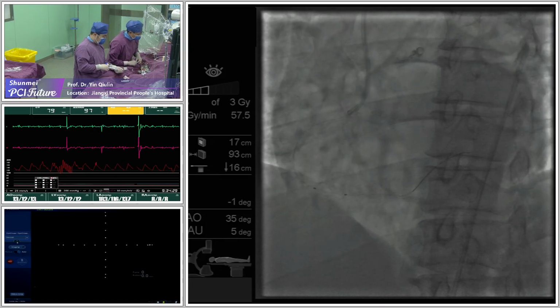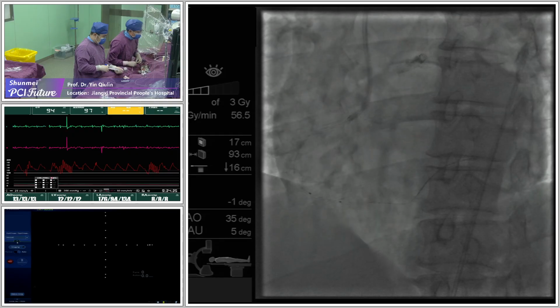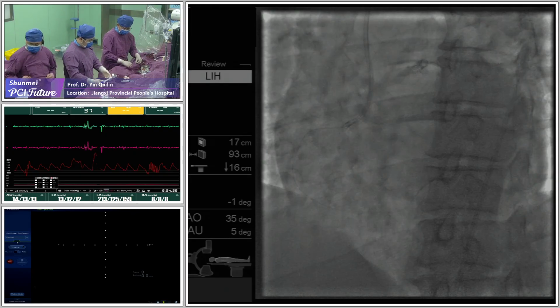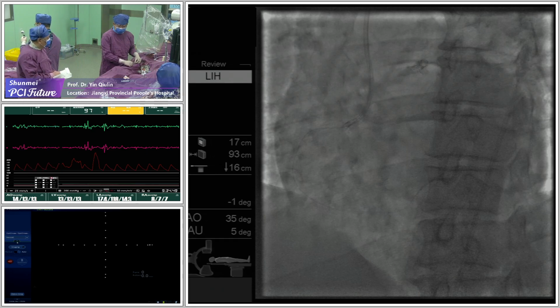We will understand that with IVUS actually, whether we are inside the stent. In my opinion, first of all, maybe a polymer jacket, and you should work with the ostium to make the guide stay properly, and then the catheter should go further.